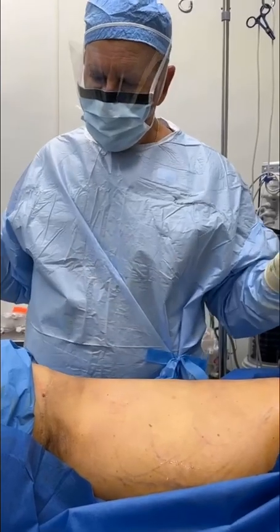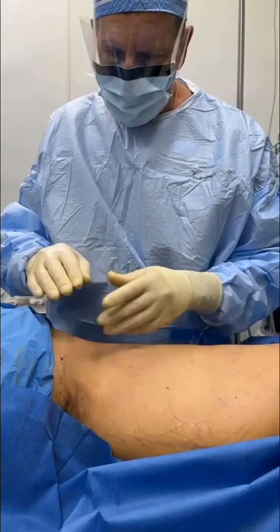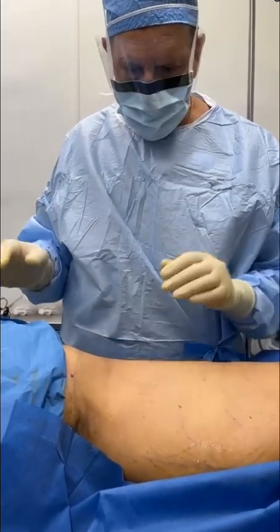This is the other side — we're basically done. Look at the nice waist. She's on her side; buttocks are over here. We're going to do a fat transfer to the buttocks. Notice how she doesn't have any excess fat — she looks incredible.